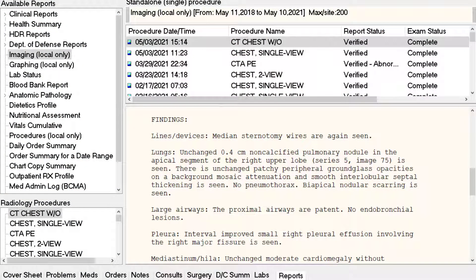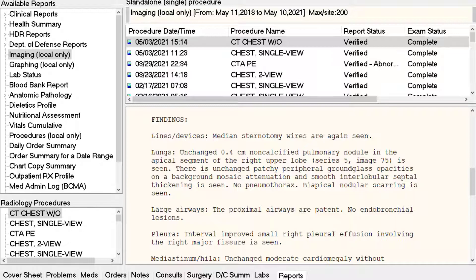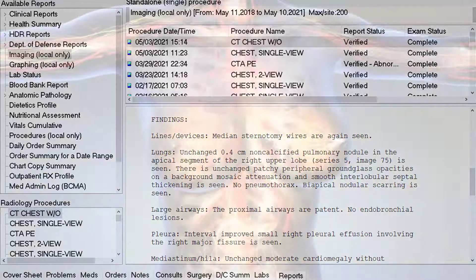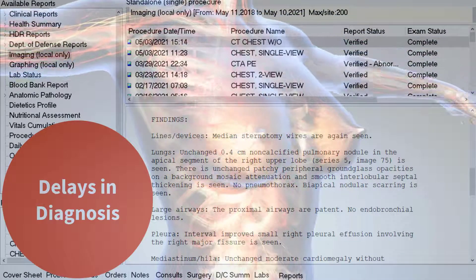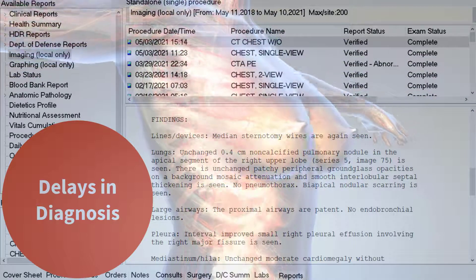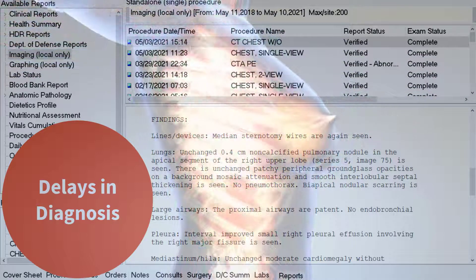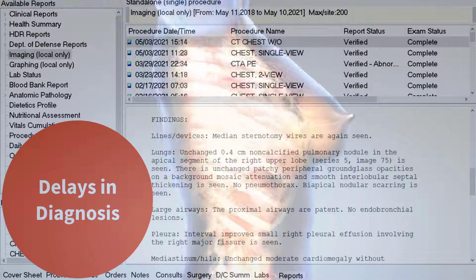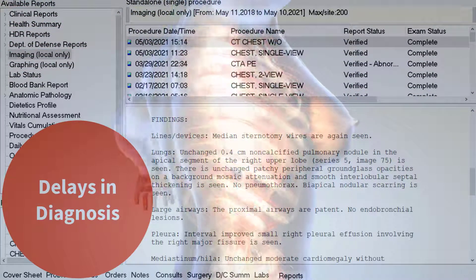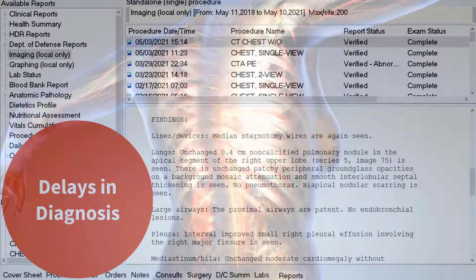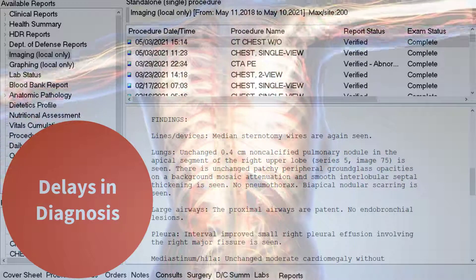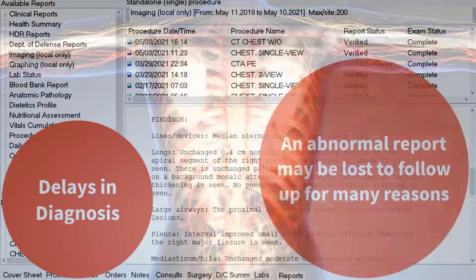Let us take a look at how to use imaging data in Brilliance and reduce the risk of clinical errors. Unfortunately, failing to follow up on imaging reports is a frequent cause of delay in diagnosis and medico-legal risk. An abnormal imaging report may be lost to follow up for many reasons.